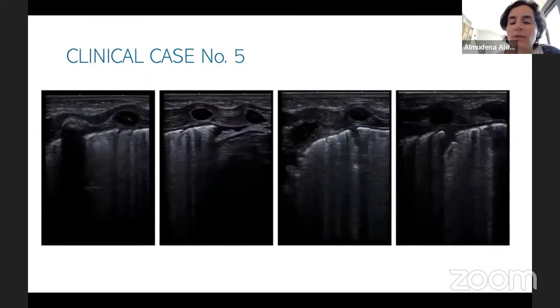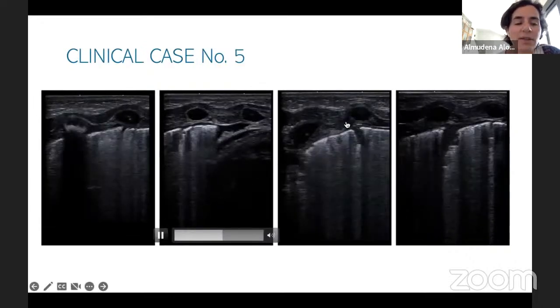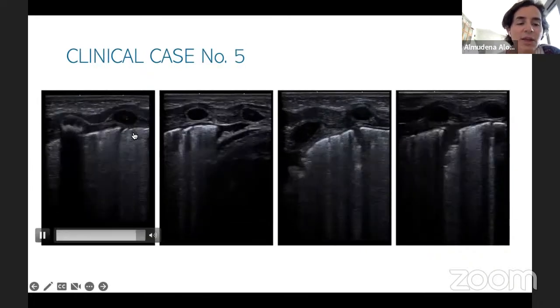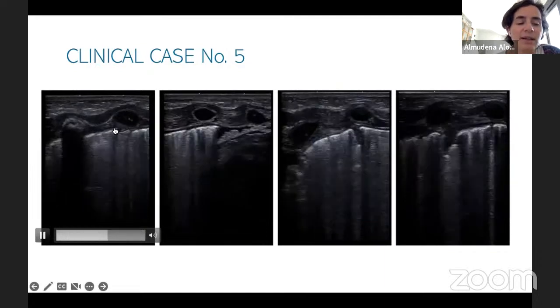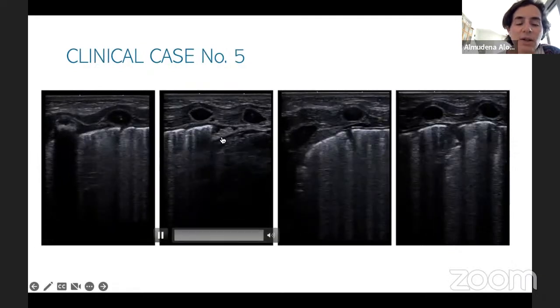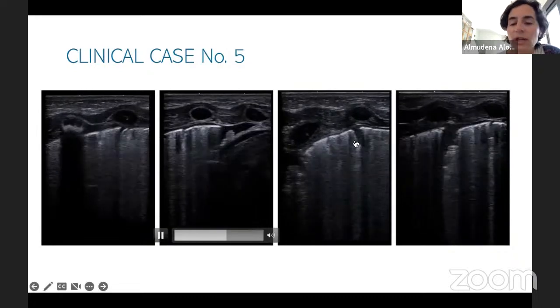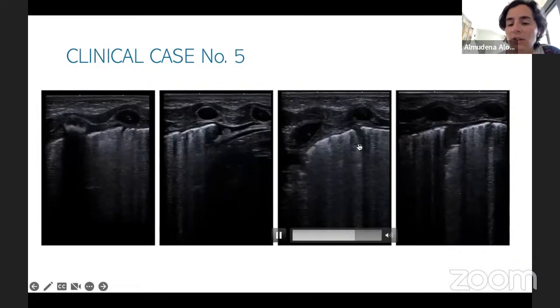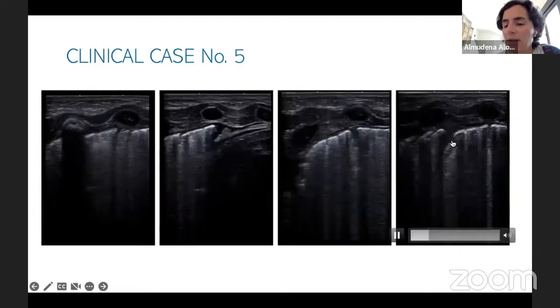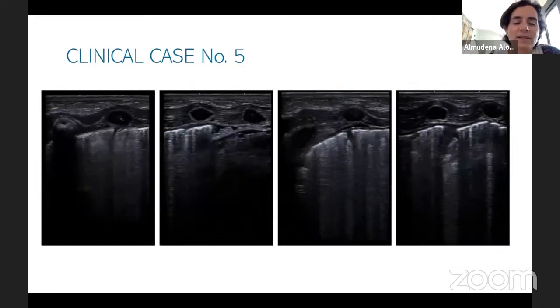And this is the first ultrasound that we performed at 3 hours of life, in which this is one lung and this is the other, upper anterior and lower anterior. You can see this thick, fragmented pleural line with lung sliding, but with lots of B lines. Also this area here with a small consolidation, with pleural effusion, a bigger consolidation here, and lots of small ones next to them. There's another one here. So this is the type of lung to which you should really pay attention.